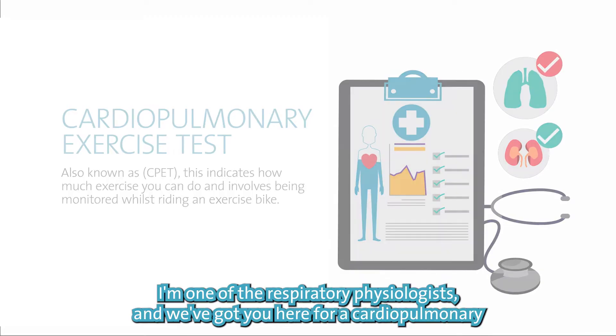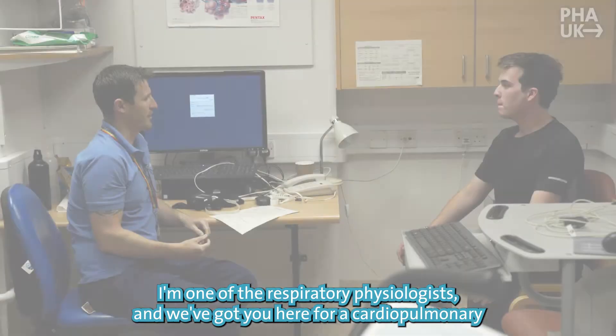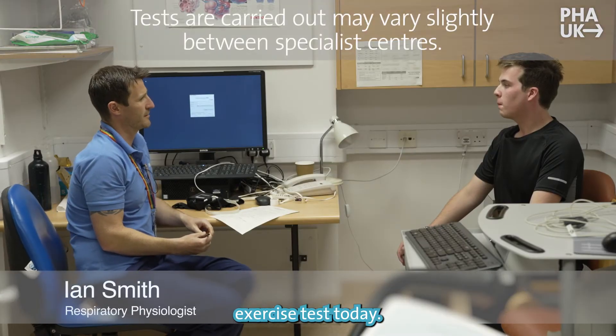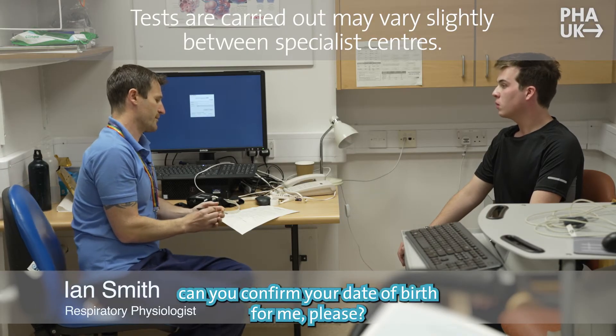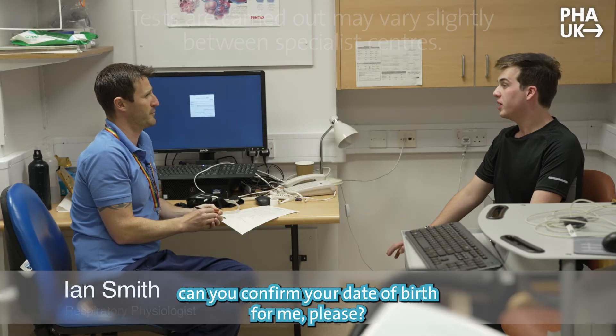Hi Adam, my name's Ian, I'm one of the respiratory physiologists and we've got you here for a cardiopulmonary exercise test today. I'm just going to check a few details if that's okay. So it's Adam Smith — can you confirm your date of birth for me please?